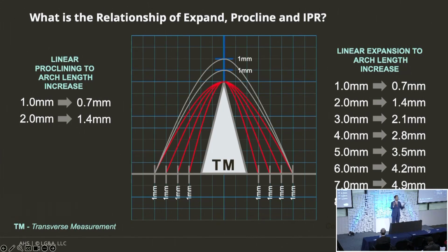How do you know how far to move the back teeth now? Well, I'd like my back teeth to be vertical and stop there, but I also know I should be between 35 and 39. Now you have an ending point. You've got half on this side and half on that side. Now I'm at 36. Wonderful. And if you only need 1 or 2 millimeters going forward, you can solve all of your tooth movement without any IPR. And this is the reason I don't have a single bit of IPR in the last 5 years. Not one case yet. 5 years running. And I'm expecting to keep that going.